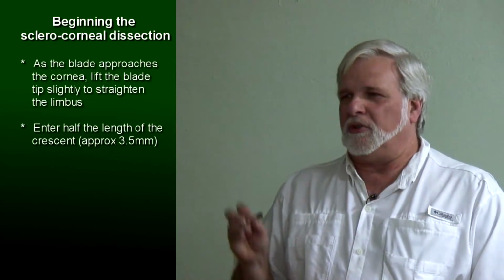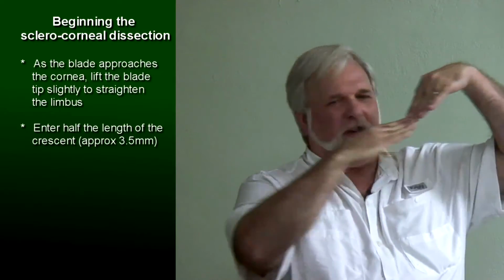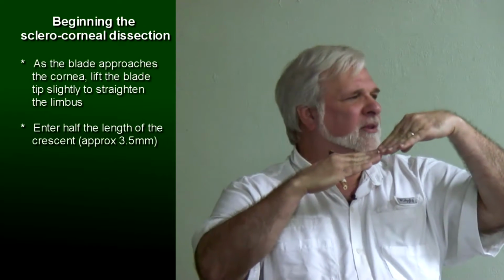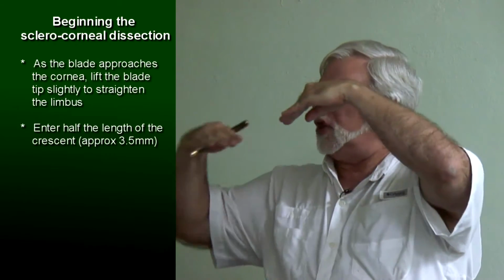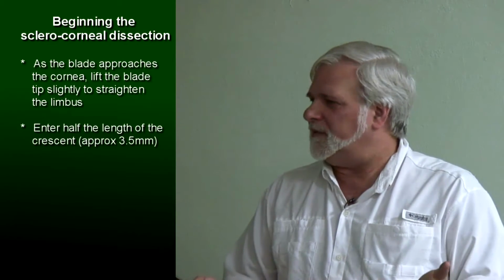As the blade approaches the cornea, you have to lift it slightly because you've got another complexity: the curve at the limbus, right? So the sclera is at this angle, the cornea is at this angle, and the limbal junction has a change in direction. But the blade is straight. So how do you compensate for that?